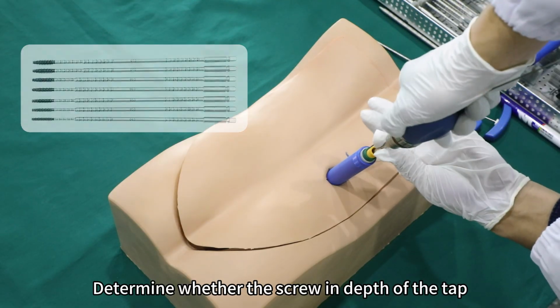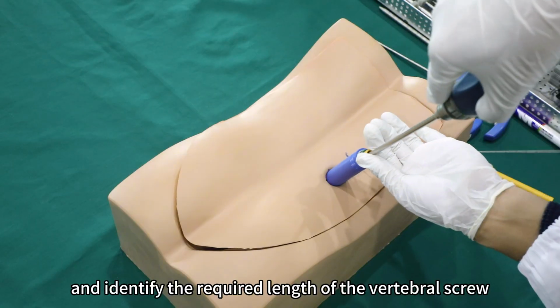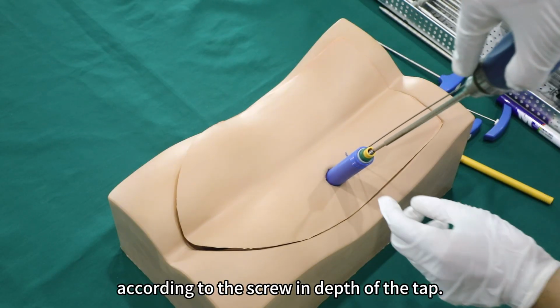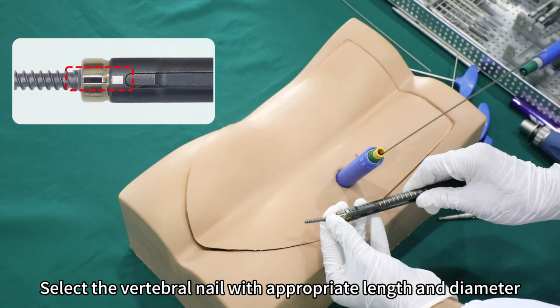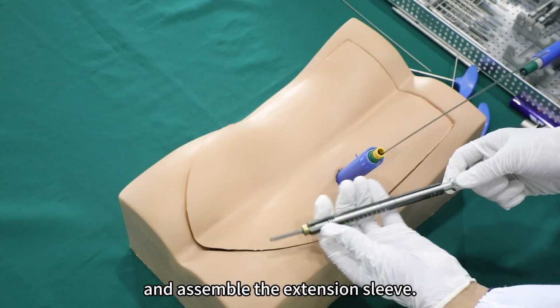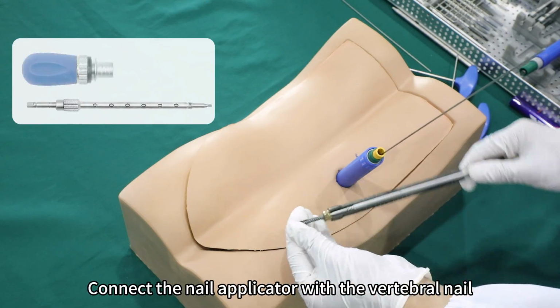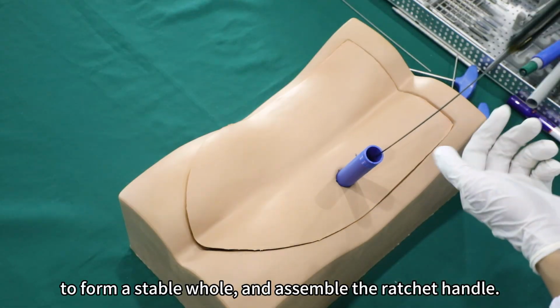Determine whether the screw-in depth of the tap is appropriate by X-ray, and identify the required length of the vertebral screw according to the screw-in depth of the tap. Select the vertebral nail with appropriate length and diameter, and assemble the extension sleeve. Connect the nail applicator with the vertebral nail to form a stable whole, and assemble the ratchet handle.